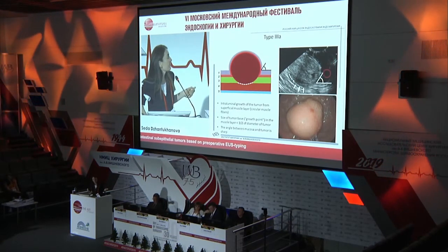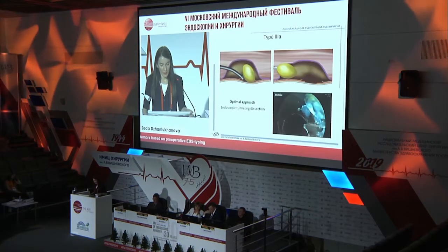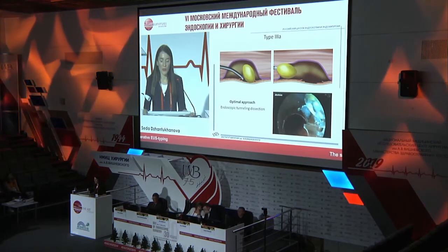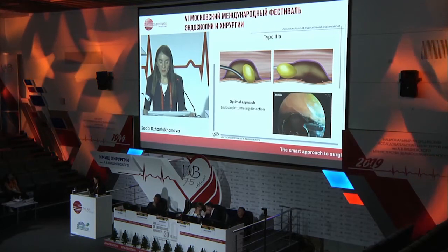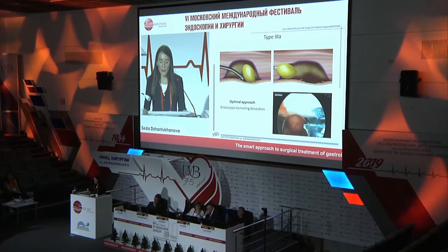And we can measure it on the EUS preoperatively. For this tumor, the optimal approach is endoscopic tunneling dissection, as you can see here on the scheme and on the short video of this procedure.